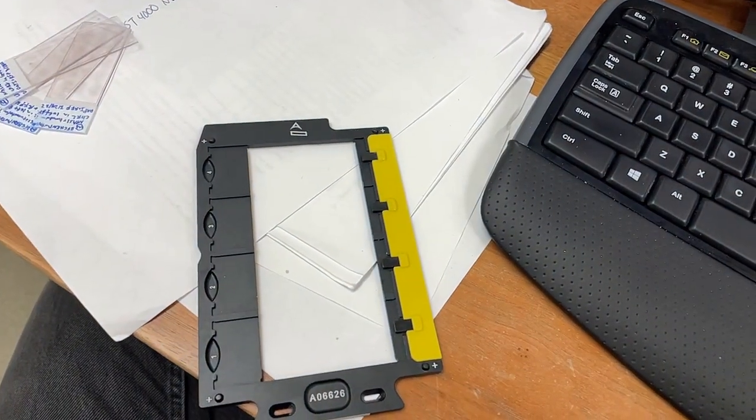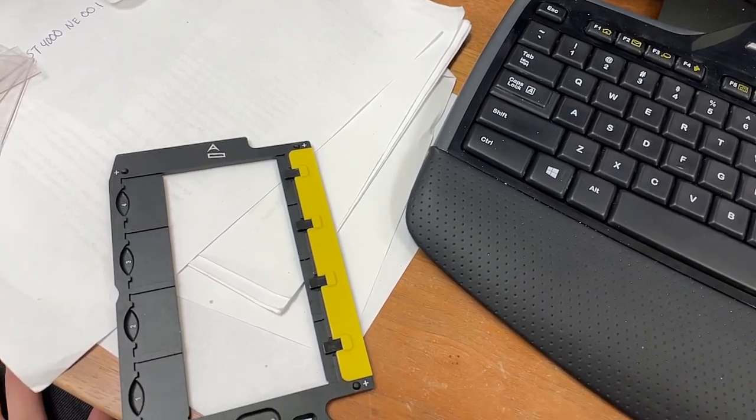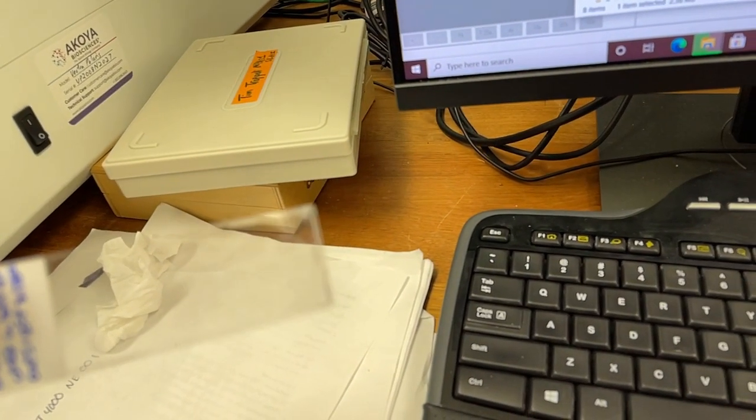Okay, I mean, they were hella blown out before. Also, I swear, each of these caddies that you load the slides into are not the same. Some of these seem to work better than others, and I couldn't tell you why. Let me just load these guys in. This is starting to be a problem. This is approaching a year old. Oops, focus. And you can see the mounting media pull away, but it's probably good enough.